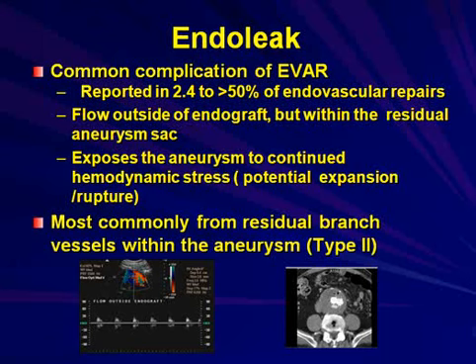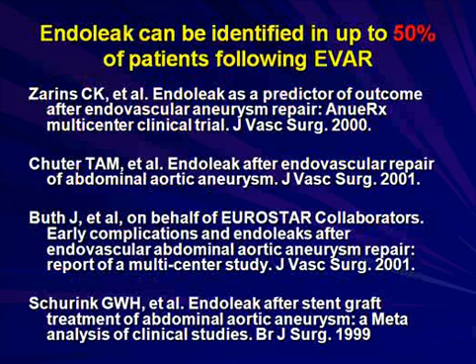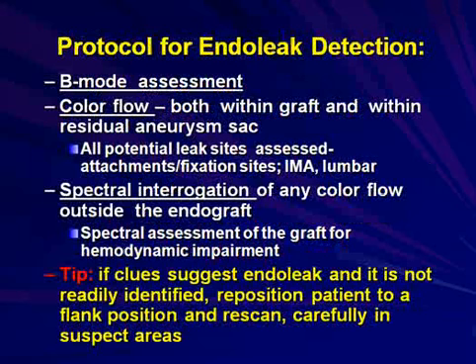It's most commonly originating from residual branch vessels, type 2, like the lumbars and the IMA. All of these references document that we can find endoleak in up to 50% of patients following EVAR.